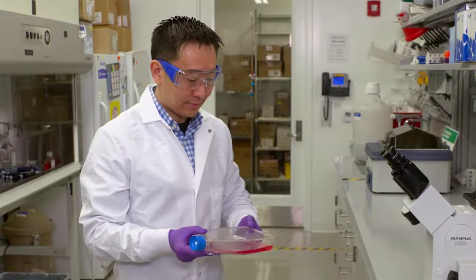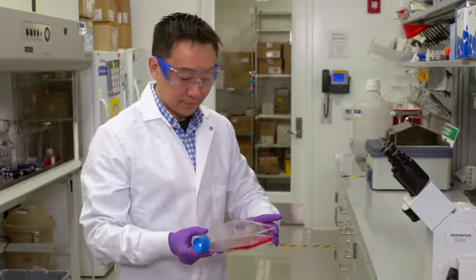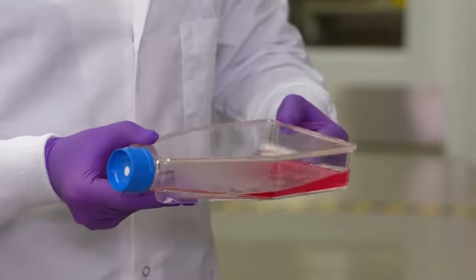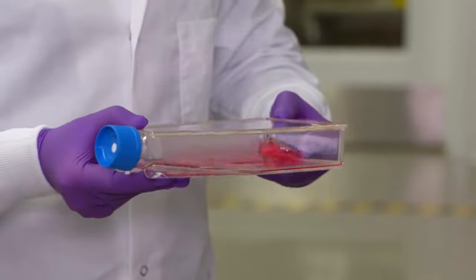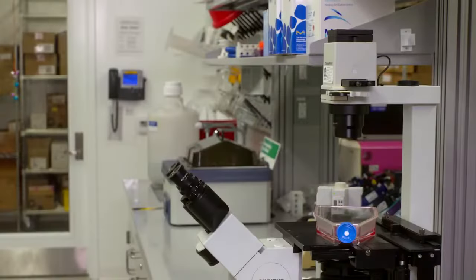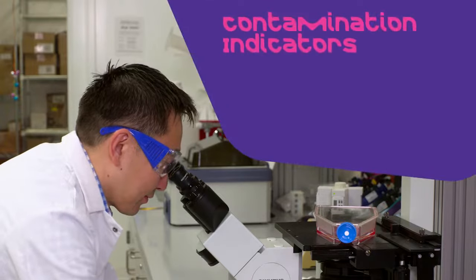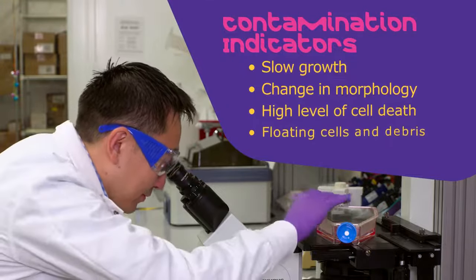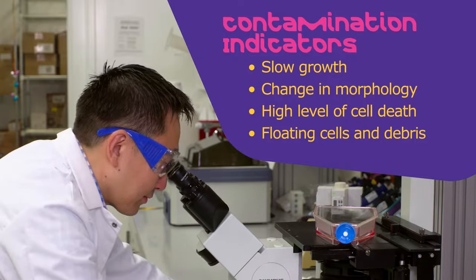Now let's switch gears and talk about contamination. Gross contamination can be easily checked by looking at the flask — media should not appear turbid or cloudy. In addition, media should not exhibit rapid color change to yellow, which would indicate the presence of rapidly growing bacterial contamination. Additional signs of contamination can also be checked under the microscope, including slow growth, change in morphology, unusually high level of cell deaths, and floating cells and debris.